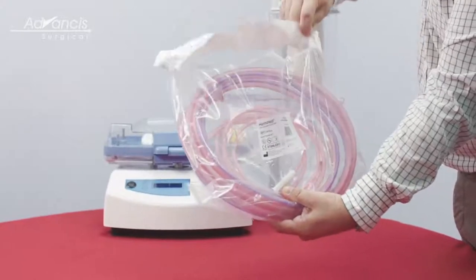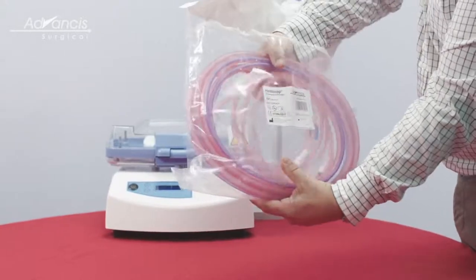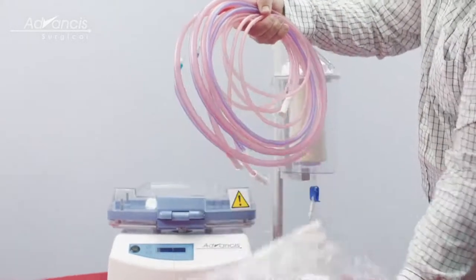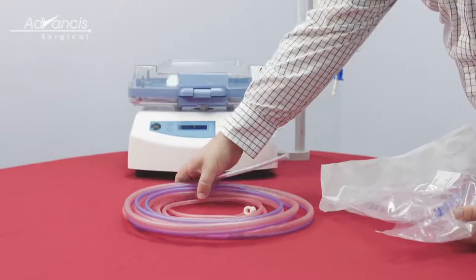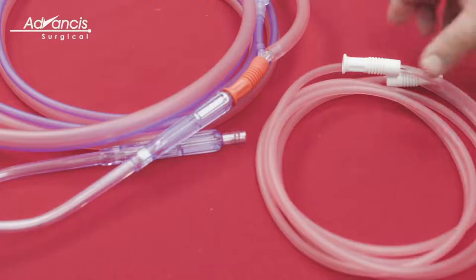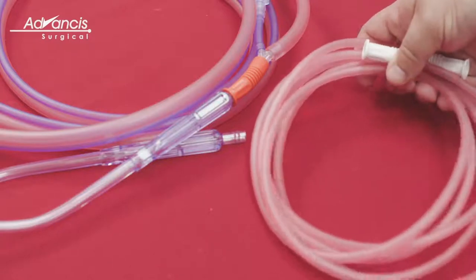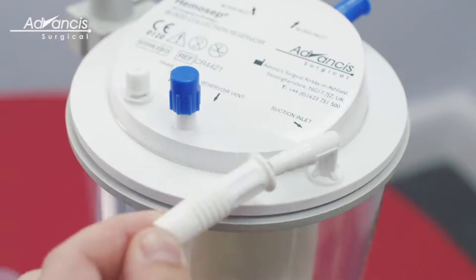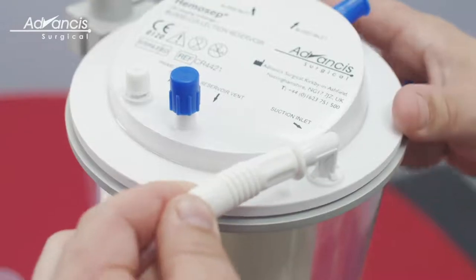Open the Hemosep Intraoperative Kit Suction and Aspiration lines aseptically and pass to the scrub nurse. Have the scrub nurse pass the single piece of red tubing to the circulator and connect this to the reservoir on the port marked Suction Inlet.